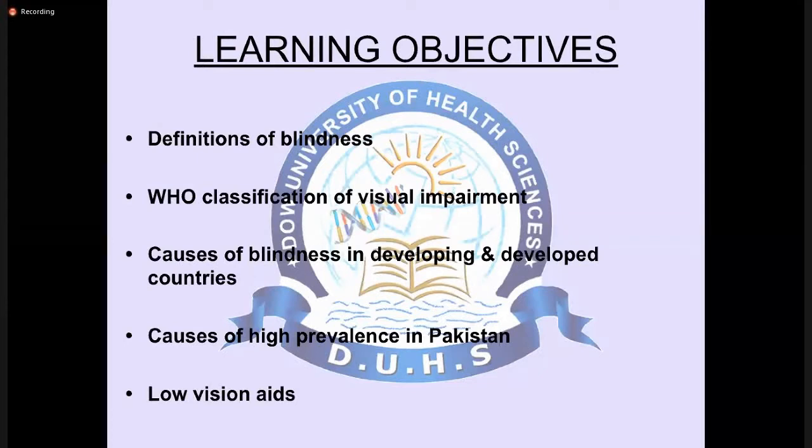If the visual acuity is 20 by 40 or less in one or both eyes, we repeat the test with the patient viewing the test chart through a pinhole occluder, and then we record these results. The pinhole occluder may be used over the patient's glasses. So this is a way to test distance visual acuity.